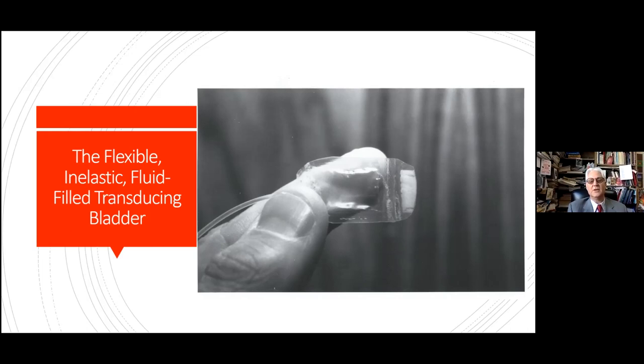And then there is a high pressure hosing, polyethylene hosing, that you could put into this system so that when you heat seal it, you could fill this bladder, I call it a bladder, with saline or water. It would expand to be the one of those vessels that's applied to the eye. And then there'd be a continuity of the fluid column from what was inside of the little bladder through this line to the pressure transducer.